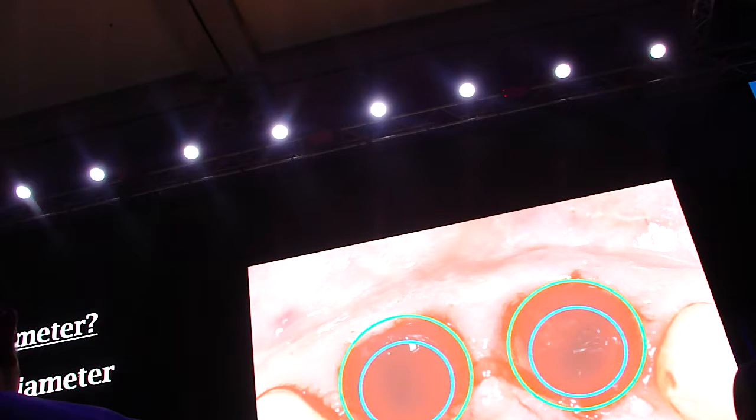There are two reasons. Some have a fear of the microgap. If you have a dirty microgap, loose connection, stinking abutments, if you have smell when you take off the abutments, it's a loose microgap. This microgap will exert a 1.5 millimeter influence on the surrounding bone mesiodistally. This is what created the distance rules of 3 millimeters. It's based on dirty microgaps. And the same thing happens to the buccal side, of course.